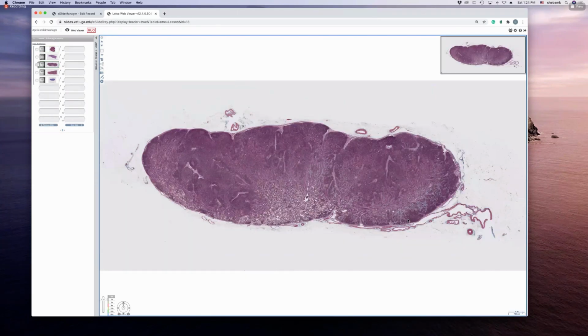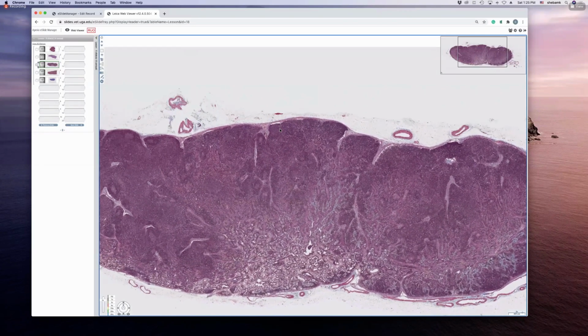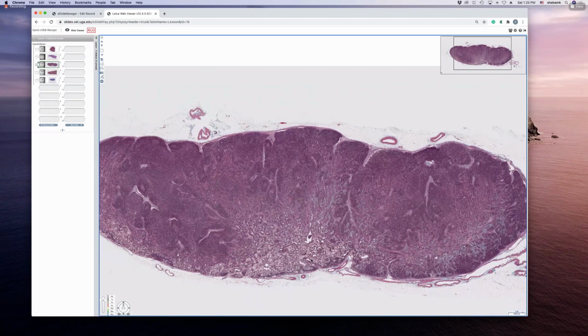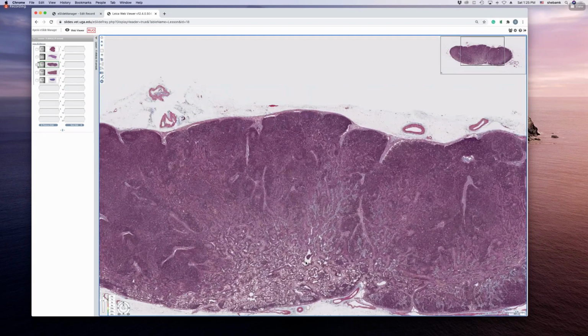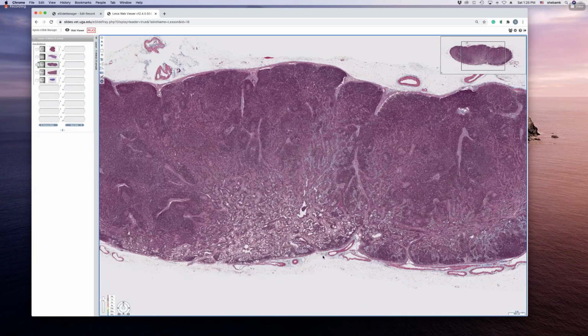This is another trichrome of another lymph node. Here you can see the trabeculae coming in. You can see the subcapsular sinus. Okay, let's go closer. See, that's the subcapsular sinus. There's the trabecular sinus, okay? And all these medullary cords and sinuses in the medulla, efferent lymphatics coming out, okay? All those are efferent lymphatics coming out.